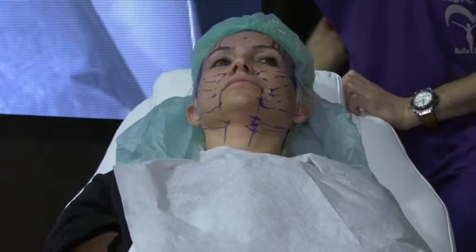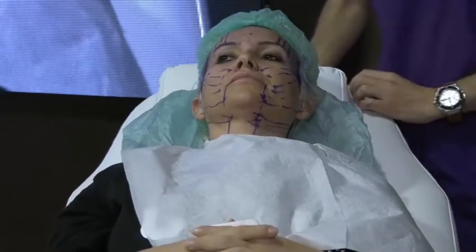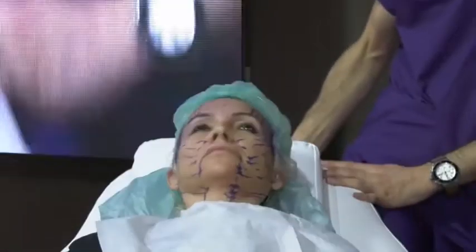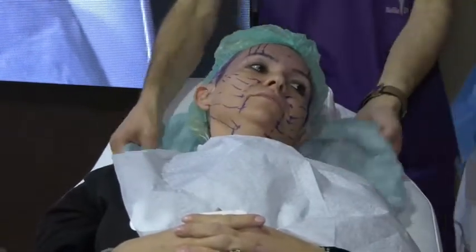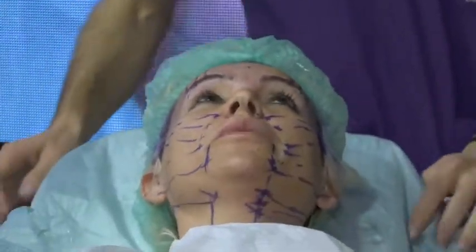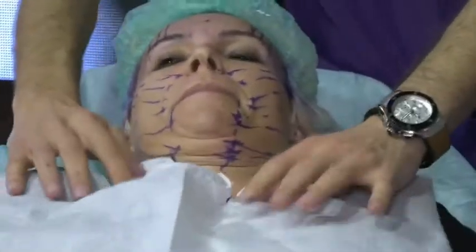If anybody wants to bring coffee or do something, I'll just prepare the anesthesia. How much sodium bicarb? 10%. Like, for example, you prepare 20 cc of anesthesia, you put 2 cc of sodium bicarb.